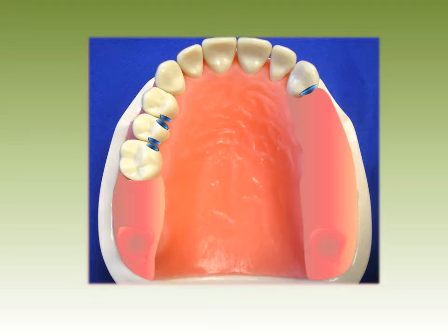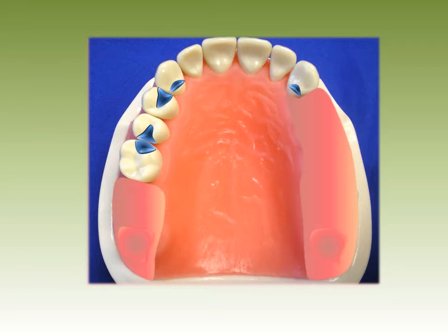Next we want to place rest seats. We'll consider potential fulcrum lines and clasp types here. Let's use the double occlusal rest seat on the mesial of the molar and distal of the bicuspid. We'll extend the rest on the bicuspid to provide some stabilization. We'll also rest the first bicuspid with an extended occlusal rest, to provide resistance to lateral movement of this periodontally weakened tooth.